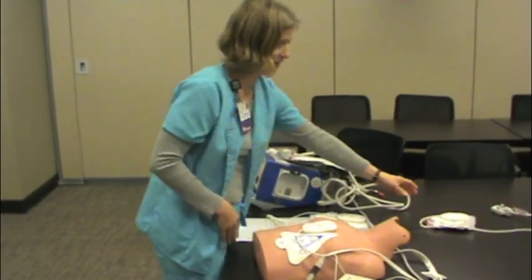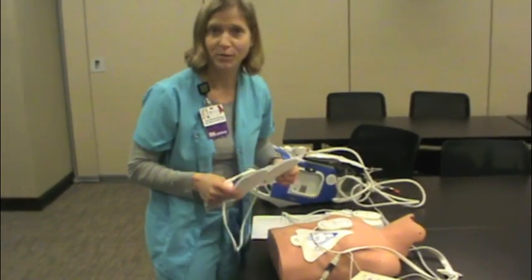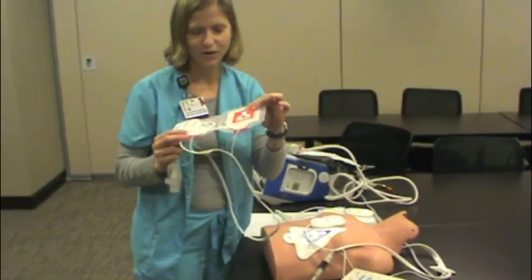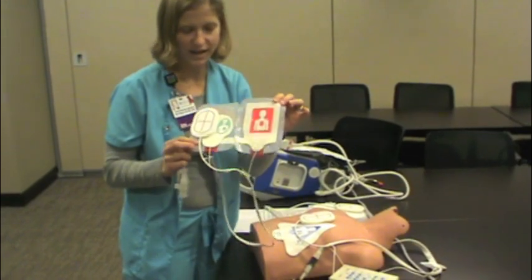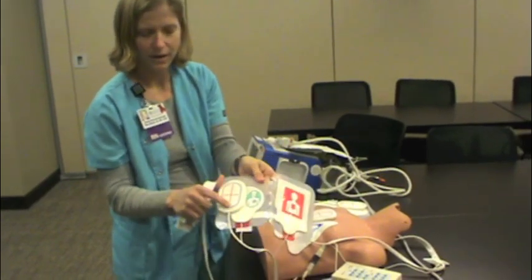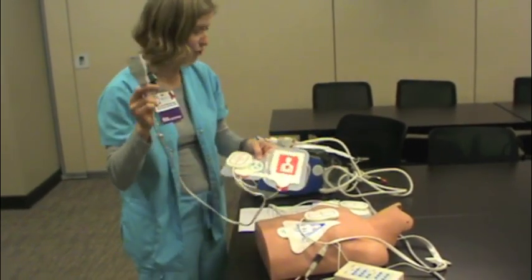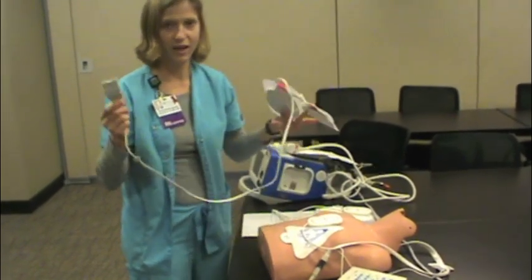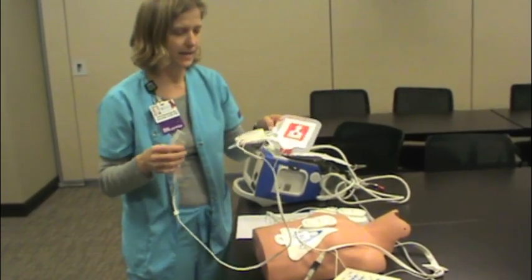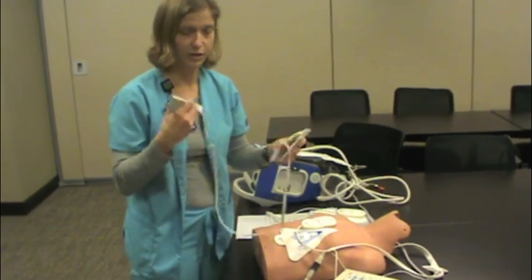We also have pediatric pads. Let us all pause and pray to God that we never have to code a child, but if we do, and if your unit has pediatrics, you'll have these pediatric pads. They use the same anterior-posterior placement with the CPR feedback device on the sternum. When you plug these in, it automatically tells the defibrillator that you have a child hooked up, so it will dial down the joules for you and give you feedback that's appropriate for a child.